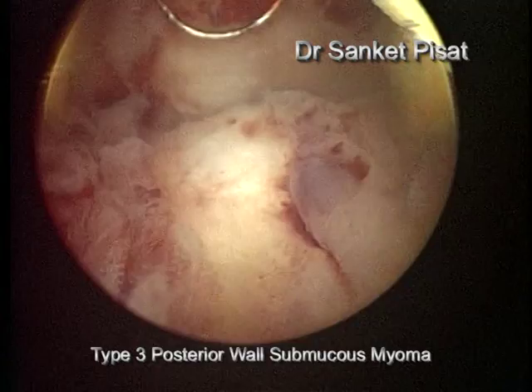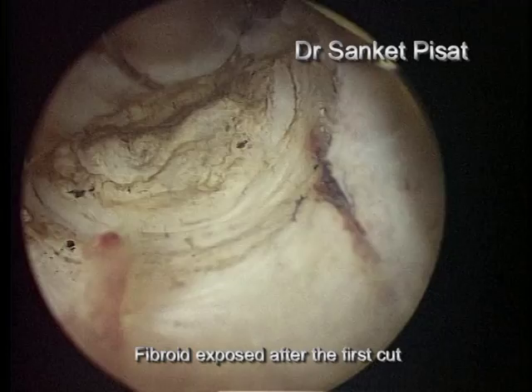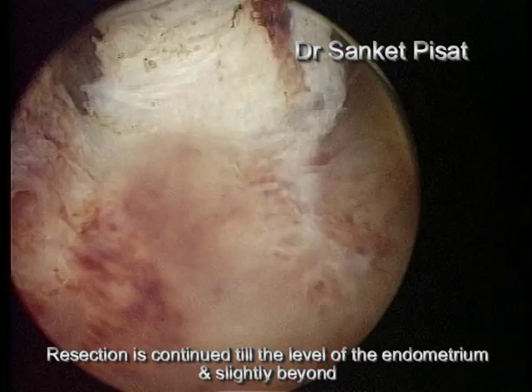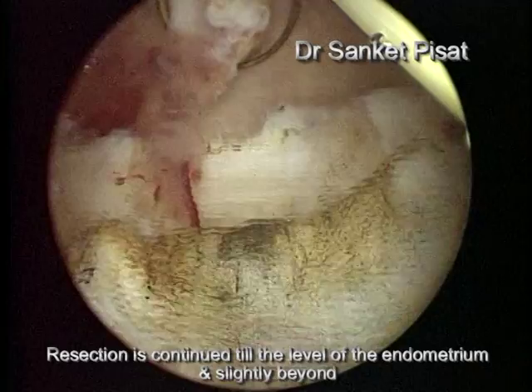This is a patient with a type 3 posterior wall submucous fibroid. The fibroid is only slightly jutting or touching the endometrial cavity but most of the fibroid is still within the uterine wall. It is only after the first primary cut has been made that the fibroid is seen. Notice the difference in color and texture between the myoma and the surrounding normal myometrium.